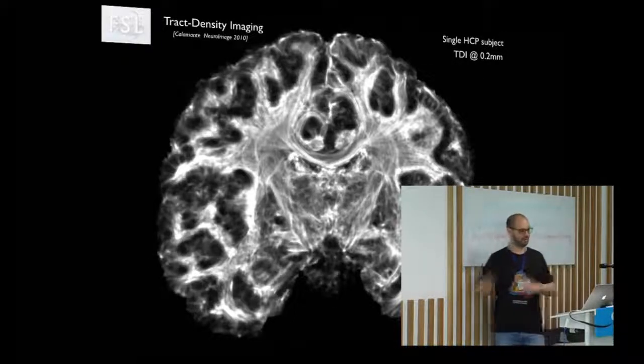So you can get these kinds of results not by actually sampling 200 micron voxels, which not even the best scanner in the world can do at the moment, unless you're doing post-mortem rodent work, of course. But you can get that by using the structural connectivity information that tractography gives you.